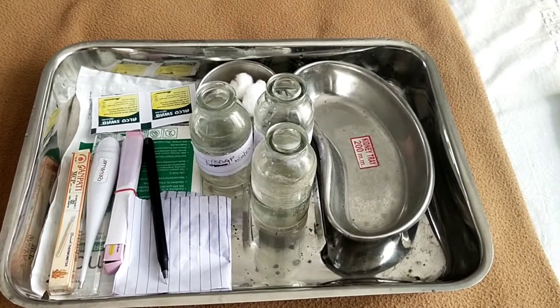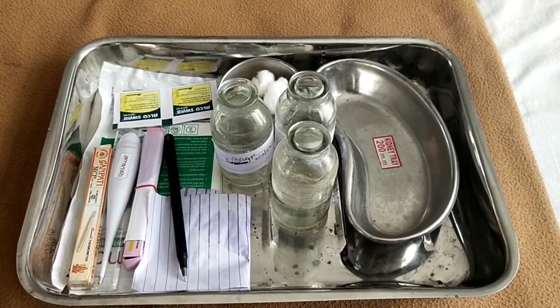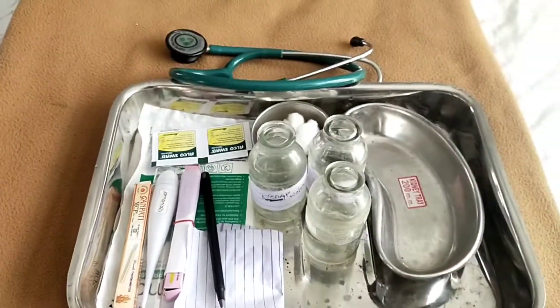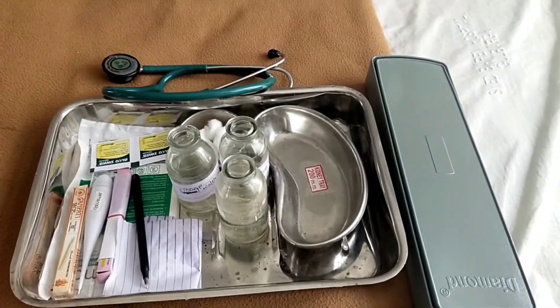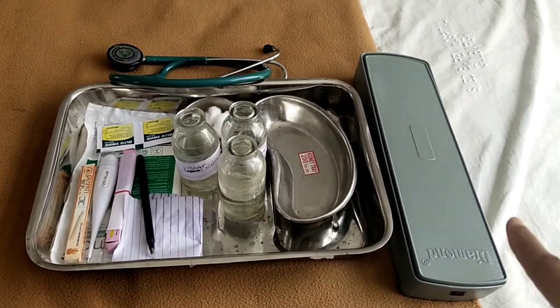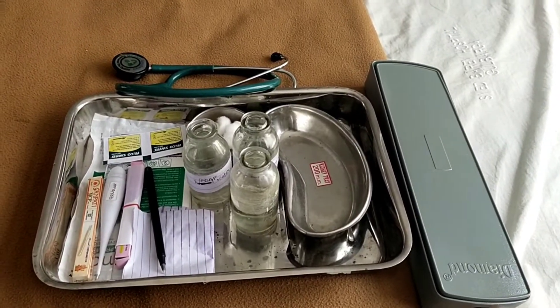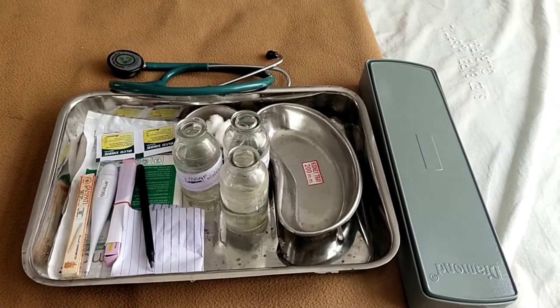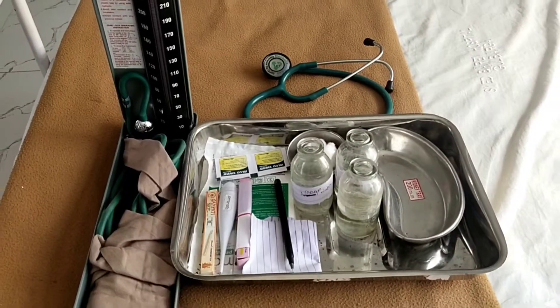If you are going to assess the complete vital signs, you have to take two more apparatus. First, I take a stethoscope. Next, I take a sphygmomanometer — that is the BP apparatus. This is the complete set of the vital signs tray.